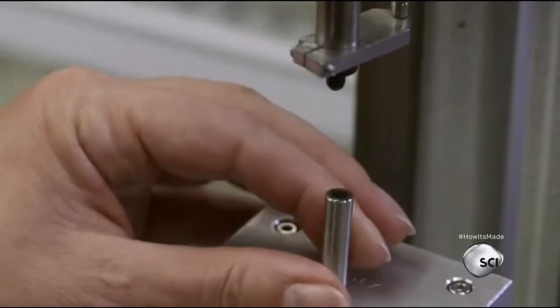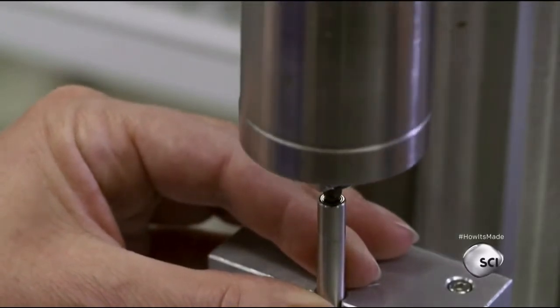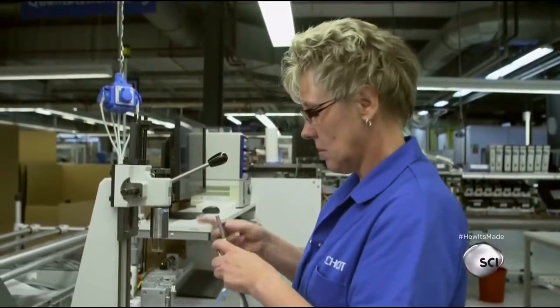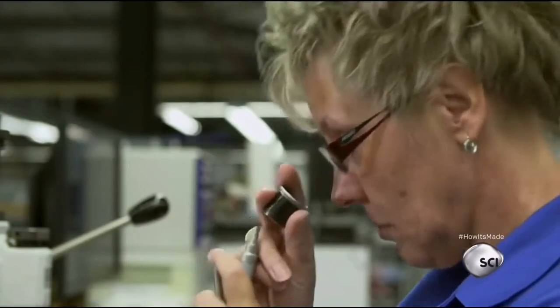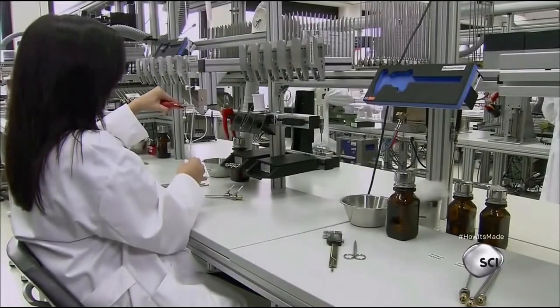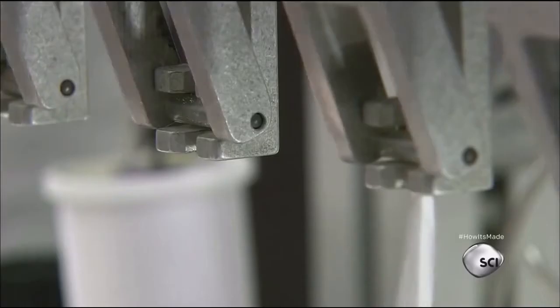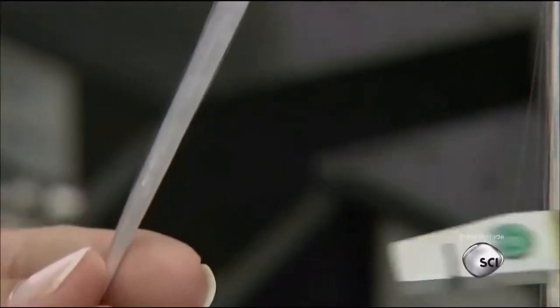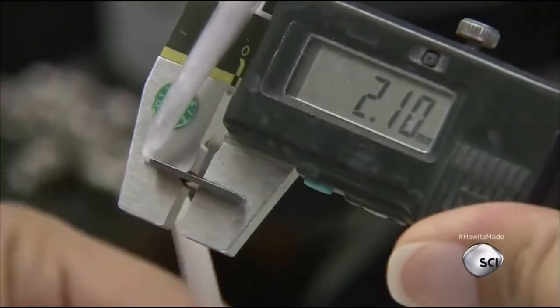This quality control test, one of several, ensures the fibers can withstand a prescribed amount of pressure without cracking. The optical fiber manufacturer also supplies fiber spools to the endoscope manufacturer for the light transmission system inside the endoscope. Workers cut the bundle of optical fibers to the length required for the endoscope model they're making. Endoscopes vary in length and diameter, depending on the part of the body they're designed for.